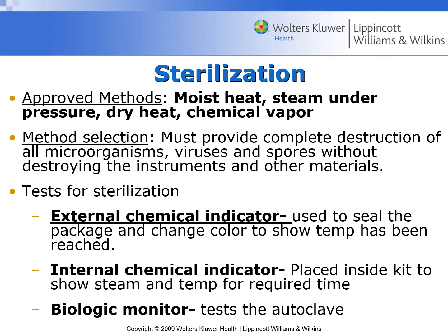So you have that packet to fill out. You can get a lot of information from this particular chapter. And if you're not finding something, look through this PowerPoint. So methods of selection, you have to provide complete destruction of all microorganisms, viruses, and spores without destroying your instruments or anything else that's in there. So that's what we're after.